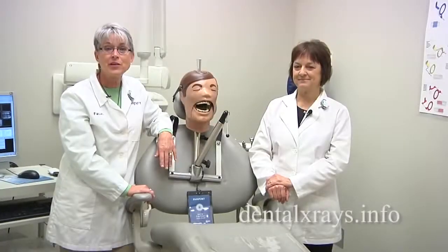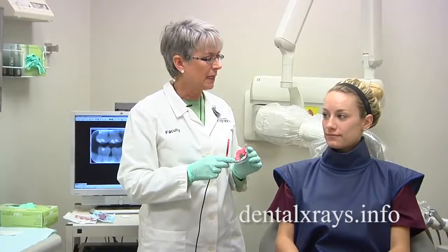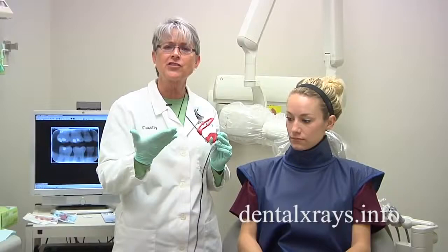Hi, I'm Sherry Ortiz, and I'm Vicki Romans, from Ask the Experts on DentalXrays.info. We've had a lot of questions about how to get bite wings to include the distal of the canine using a sensor on a narrow arch, or actually any arch at all.